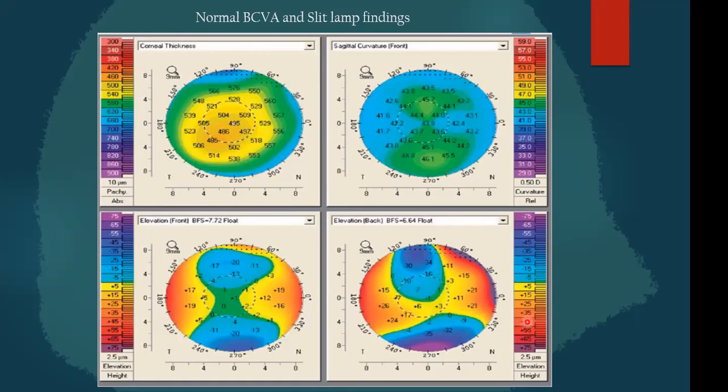Anything else, Divya? Or something else in this map? So you've got to look out for something known as posterior keratoconus. So posterior keratoconus is a condition where only the posterior cornea is going to show this area of elevation, which you can see as +26 over here.